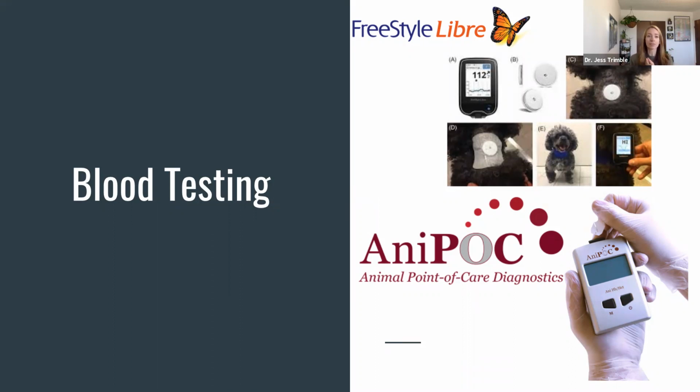And then we have the one below it that you see, that's actually a point of care analyzer for anemias. If we wanted to test anemia for a pet, I would have to take that blood sample, put it in a centrifuge, and then either run it through an analyzer or look at a microhematocrit chart. This takes a single drop of blood. Can do it in the home, no problem.